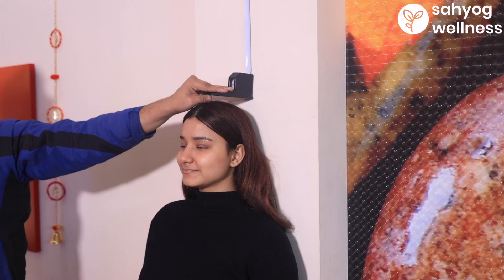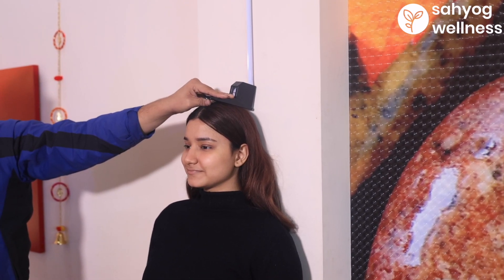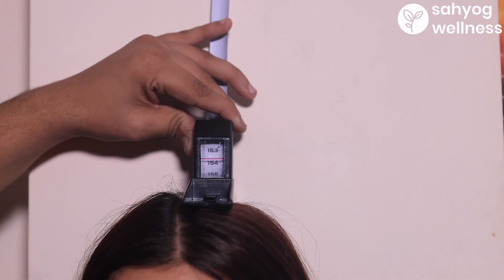To measure the height, the person has to stand and slide the stature meter till the level of the head, and it will show you the height in centimeters.